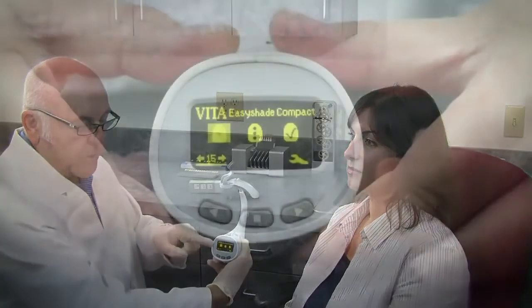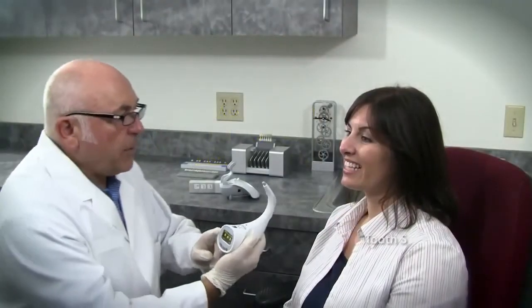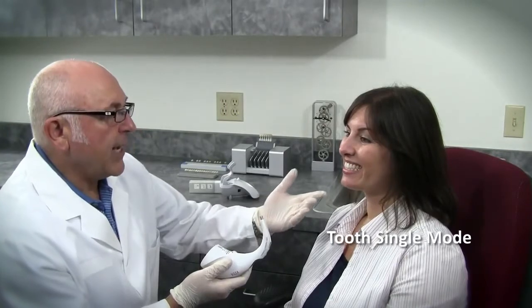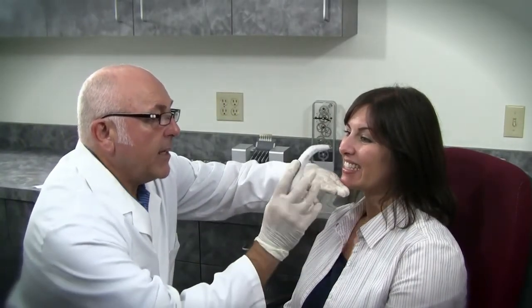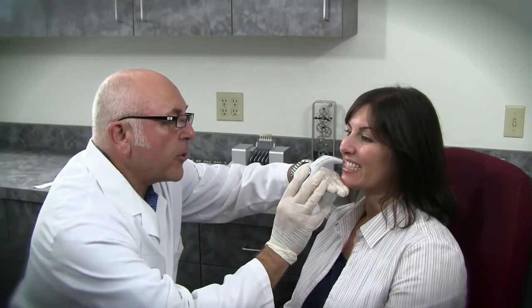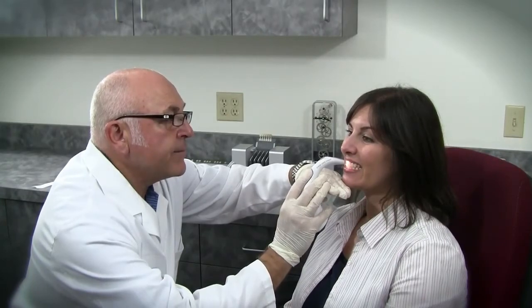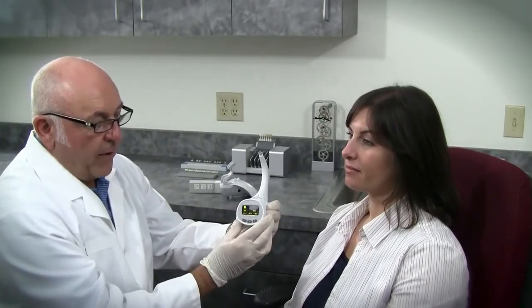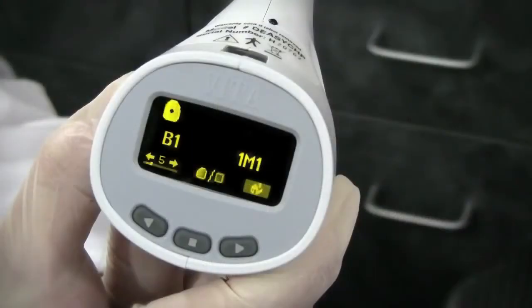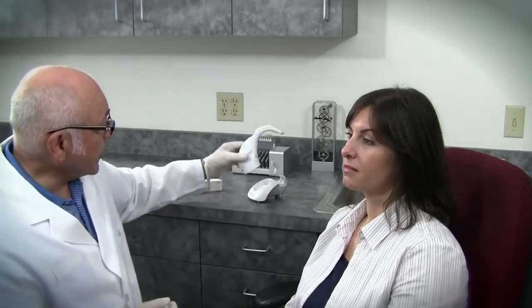I'm going to be using the tooth single mode, which is highlighted here on the screen. When I observe the patient, we're going to take the shade of her front teeth. I recommend steadying your hand if you're right-handed and placing the probe onto the tooth where the most color is. I press the button and get a shade result: B1 classical, or 1M1 in the 3D Master Shade System. For this exercise, I'm going to compare the shade of the patient using the shade guide.